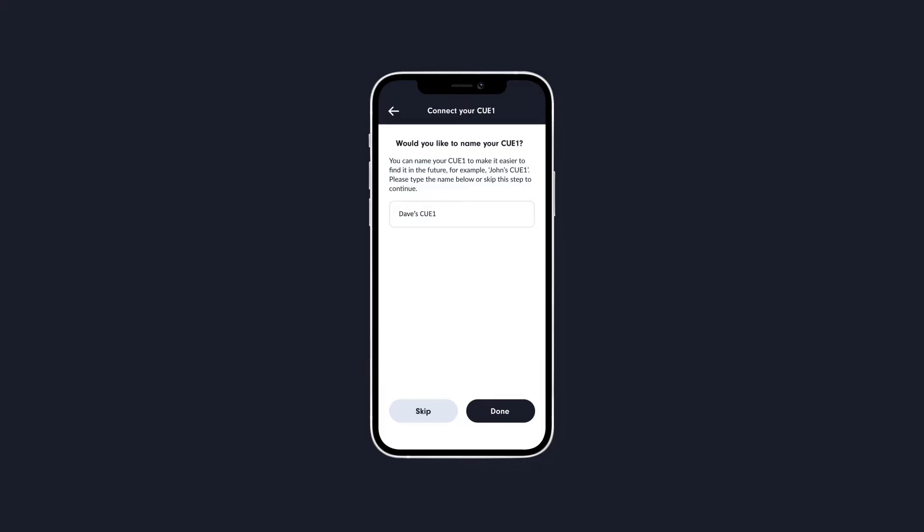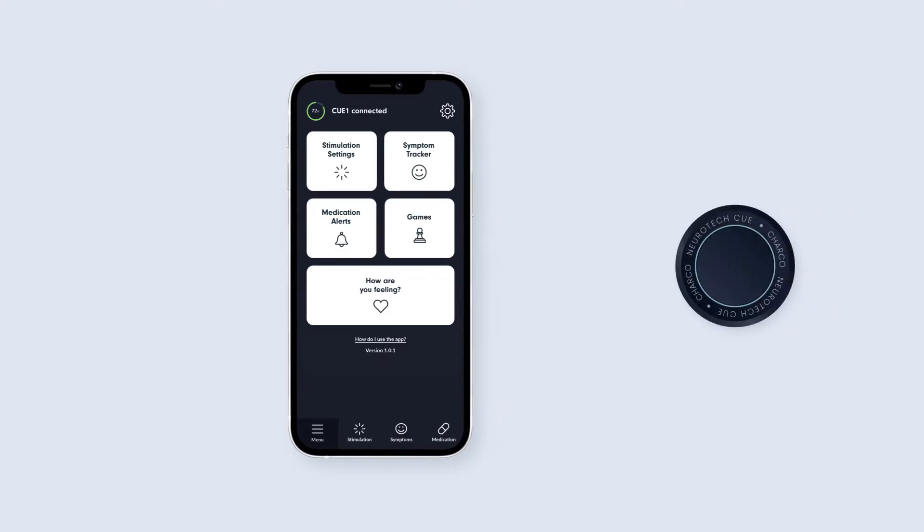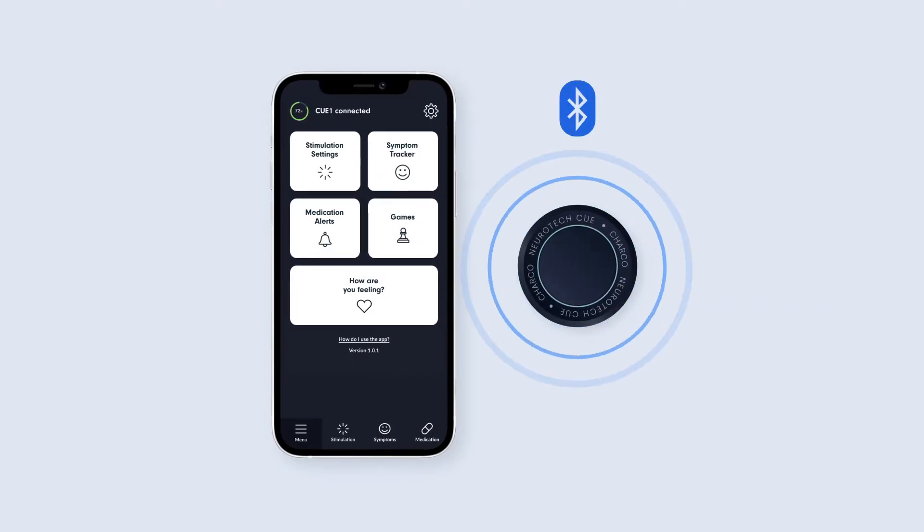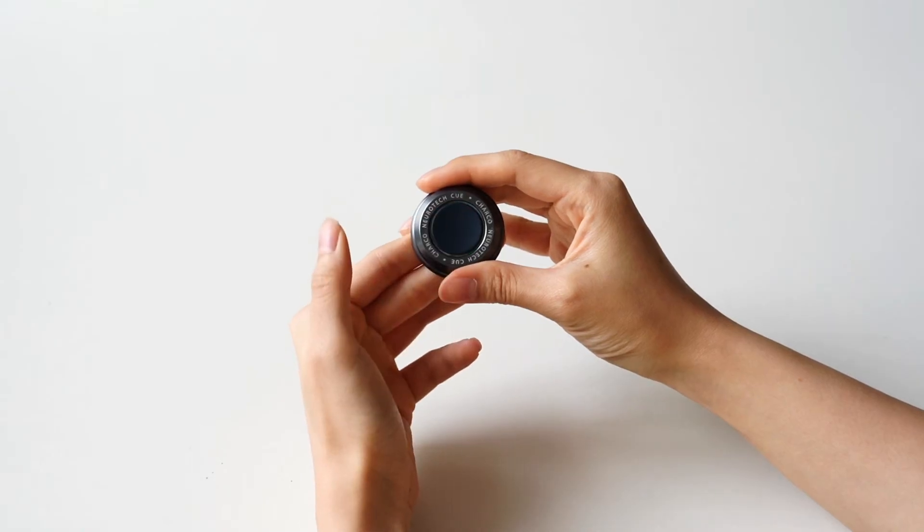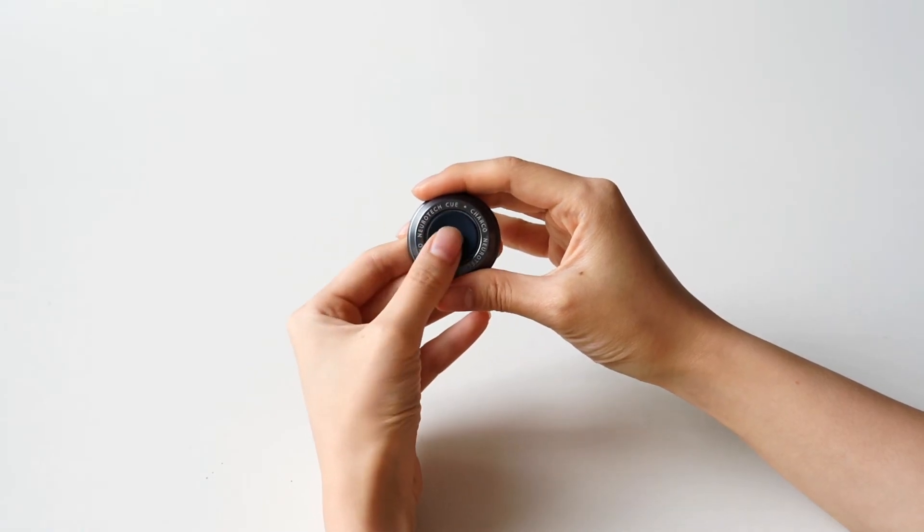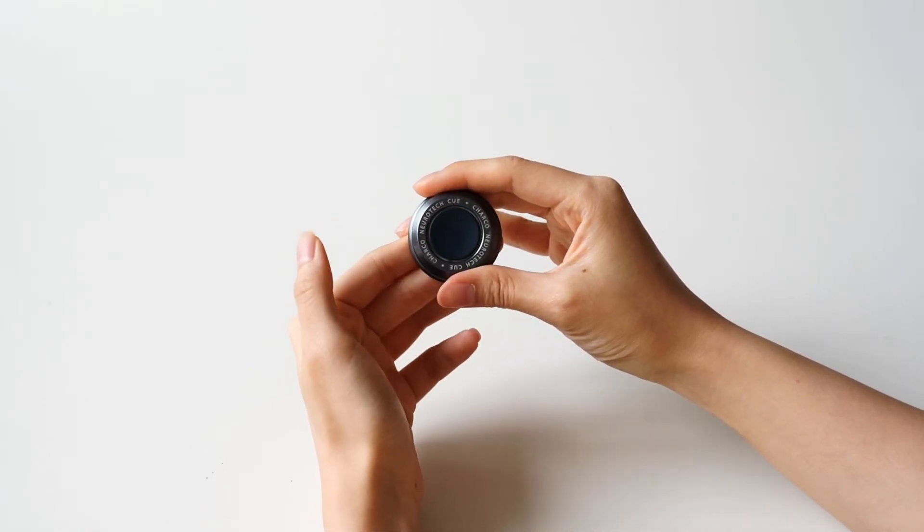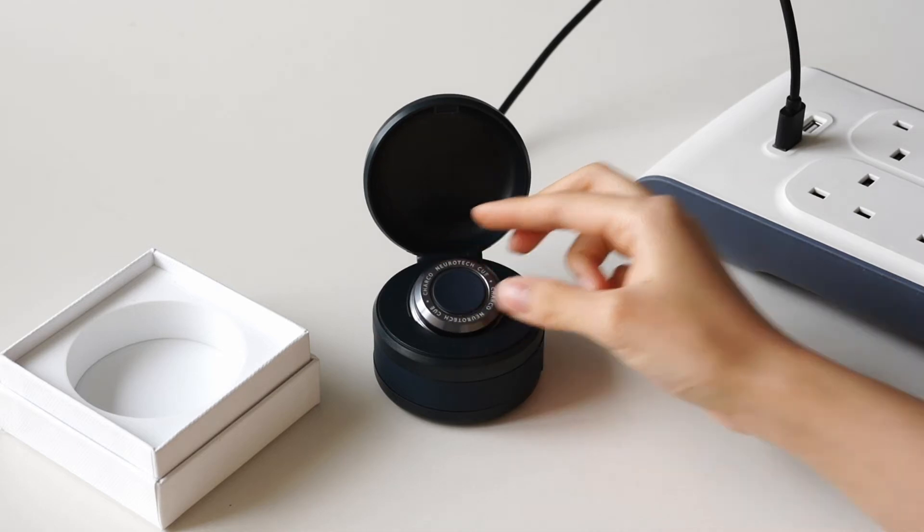After you have gone through the initial setup process, from then on, the app should connect to your Q1 automatically when opened as long as the Q1 is nearby and advertising Bluetooth. To make sure it is advertising Bluetooth, simply press the button to turn the Q1 off and on again, or place the Q1 on charge.